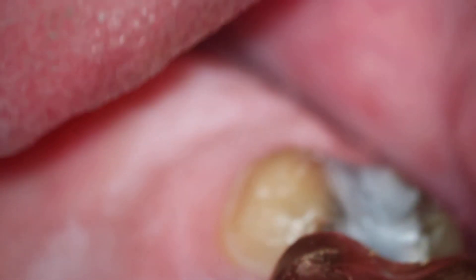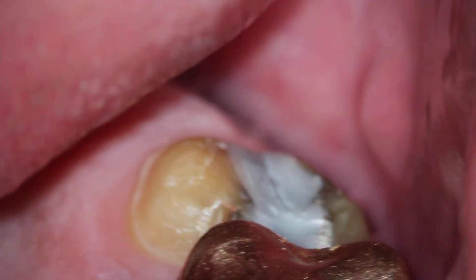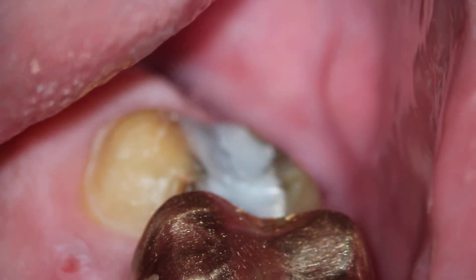A little further over — there we go. And here we have the entire palatal margin. So as you can see, we have prepped this entire second molar using direct vision.